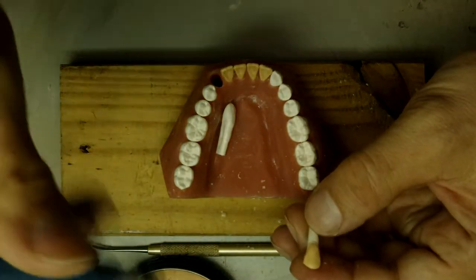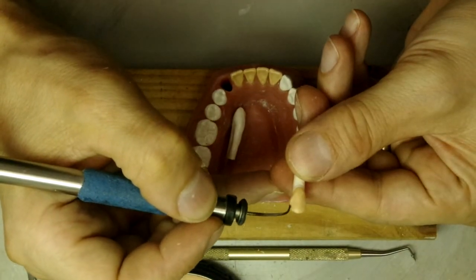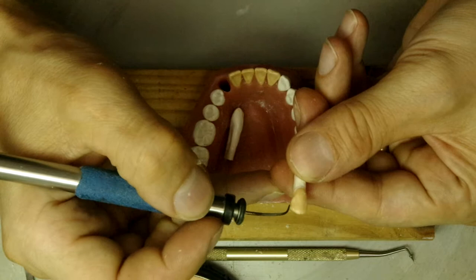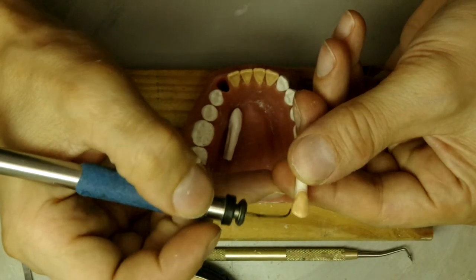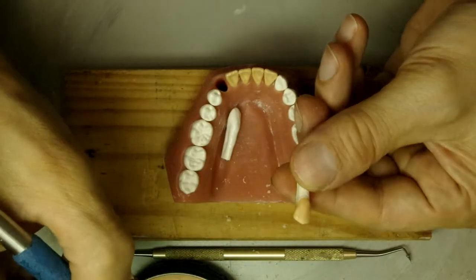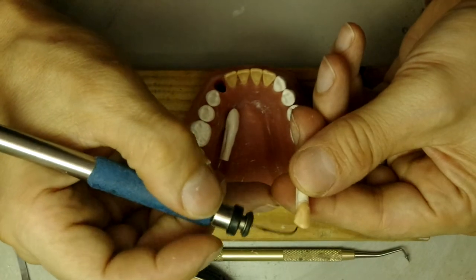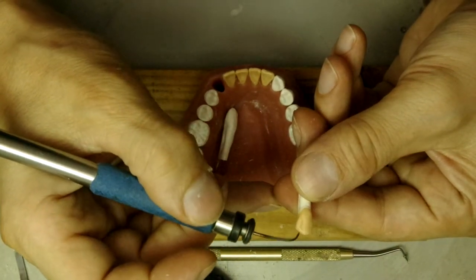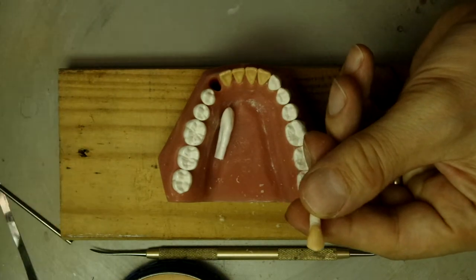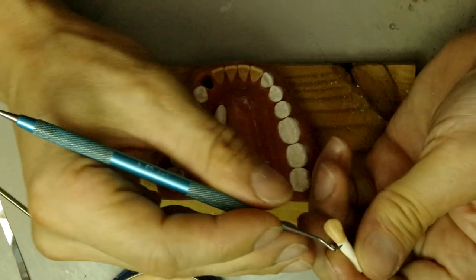And if you don't feel it's round enough, then we can take a little bit of wax and use the inherent quality of the wax that it wants to be round, and we will create a distal lobe that way. Put it in a little bit more. Remember, it only has to be a little depression. You don't want it to be a groove. Even though some people call it a developmental groove, it is a depression.